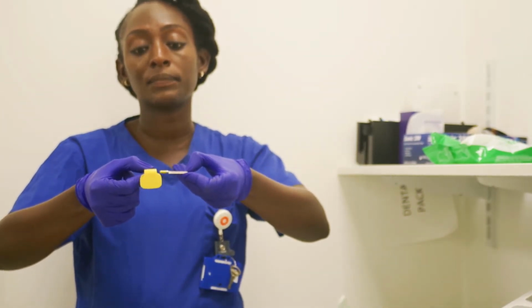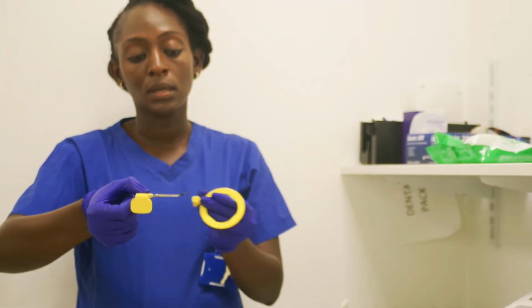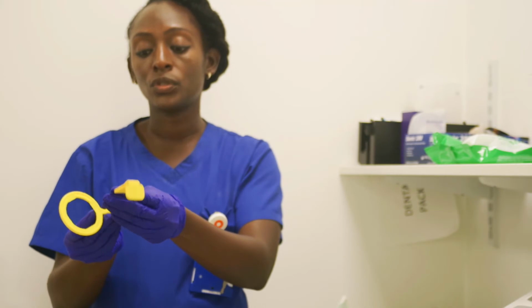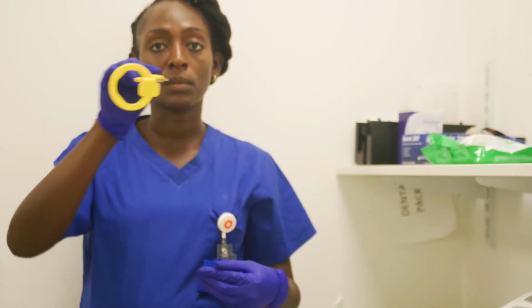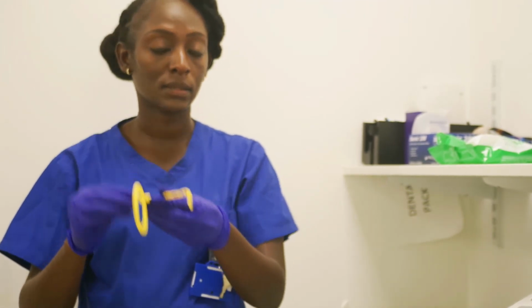So you place the metal bit on the left side like that, and then you put this part of the beam aiming device through so that you can see the receptor in the middle, nicely centered. Okay, so this is what the setup will look like. All right, so this is for the lower left 6.